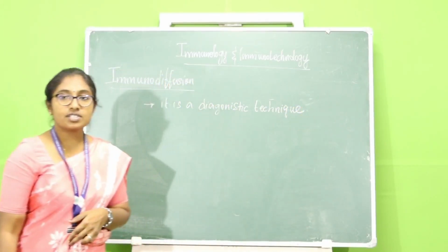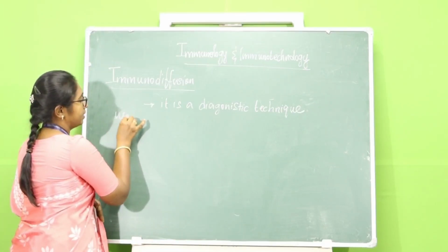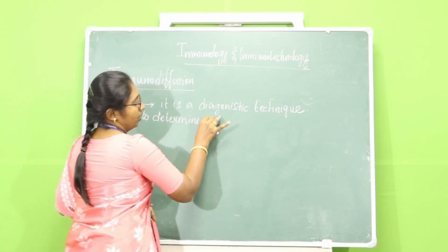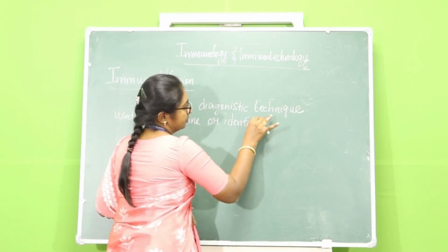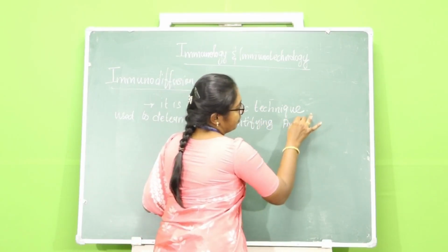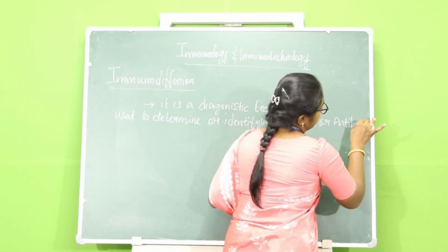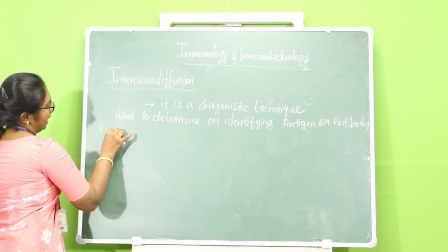Immunodiffusion is a technique used to determine or identify an antigen or antibody in a solution or in an analyte.